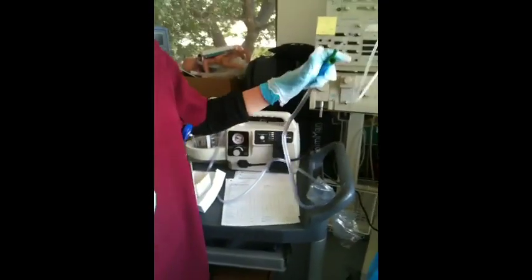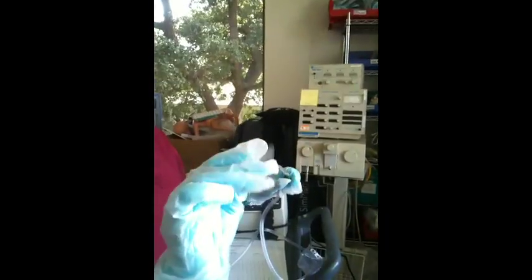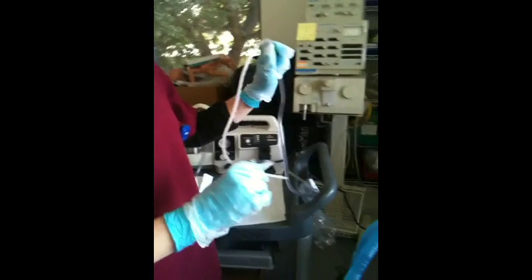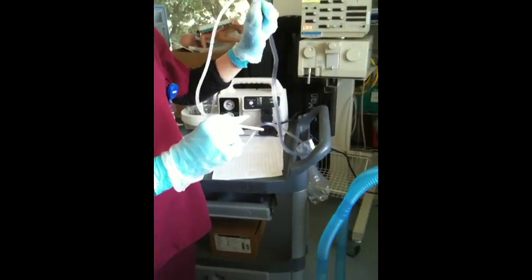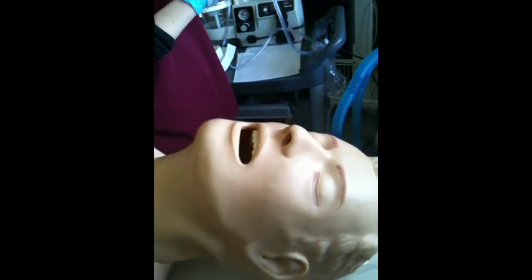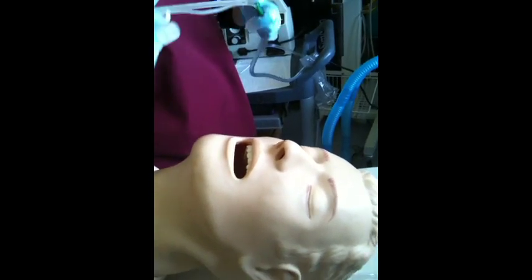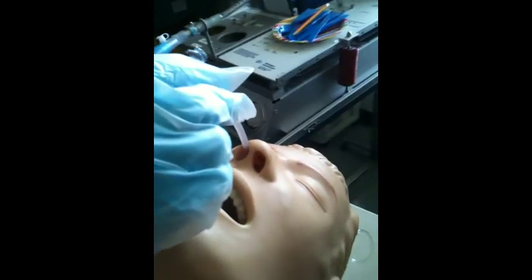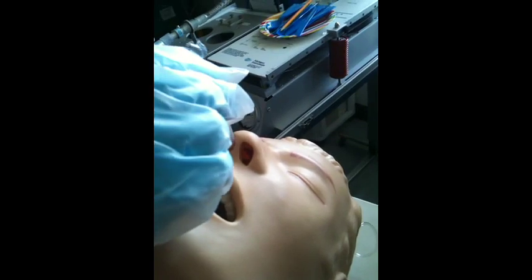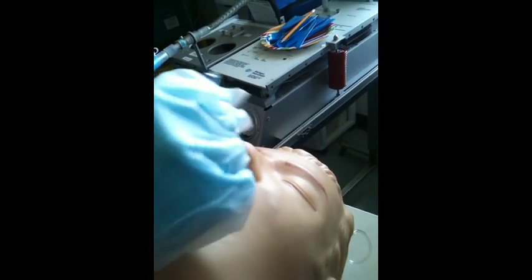The tip of the catheter is applied with lubricant to assure that it'll go in smoothly. So now that our patient is oxygenated, Gary Lynn is going to insert the catheter inside the patient's nose using a twisting motion.